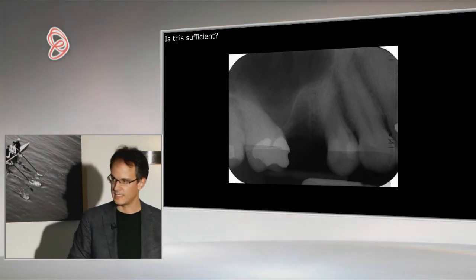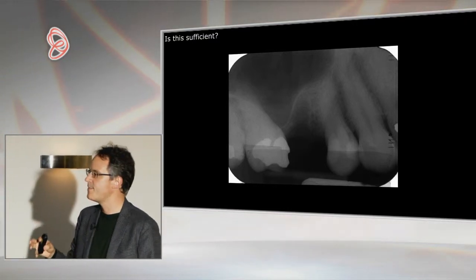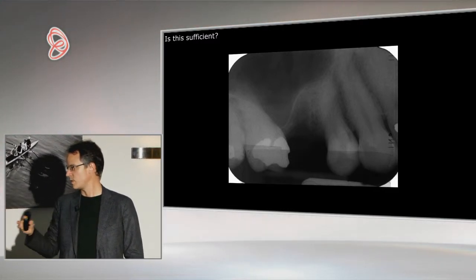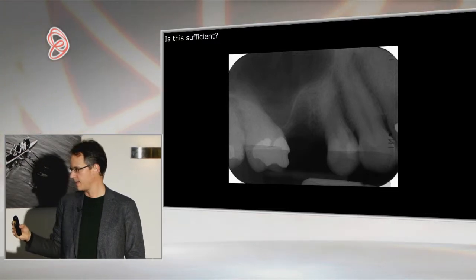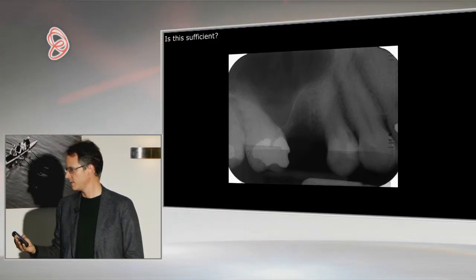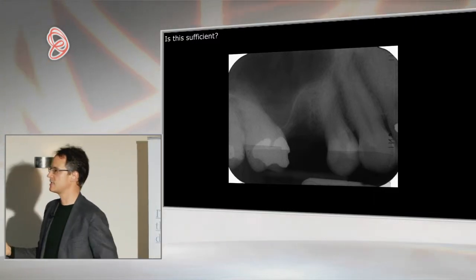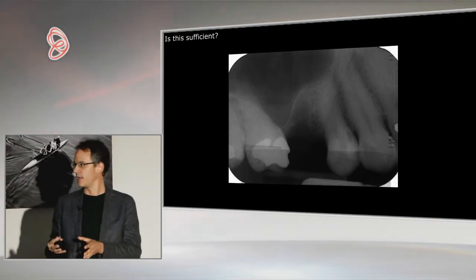With the imaging techniques and diagnostic possibilities at hand, we should be able to plan a surgery to go as planned, almost 100%. Every deviation in a surgery from the plan has to be considered as a complication, actually. When you have to deviate from the plan, it's a complication. Maybe this complication has no adverse effect for the patient, but as a complication it is there.